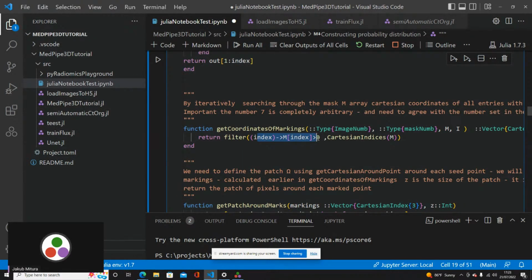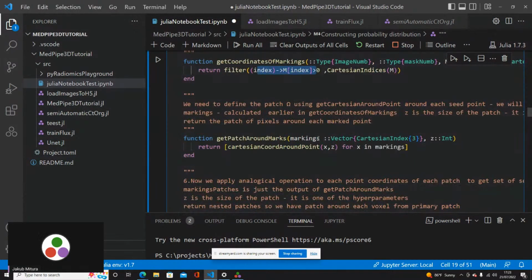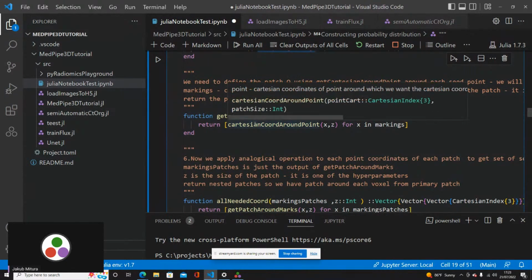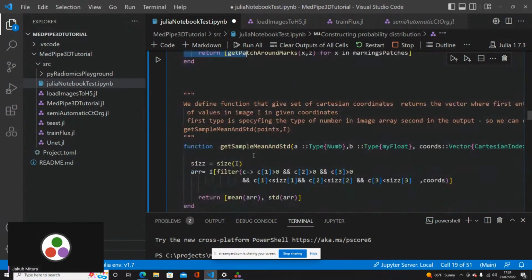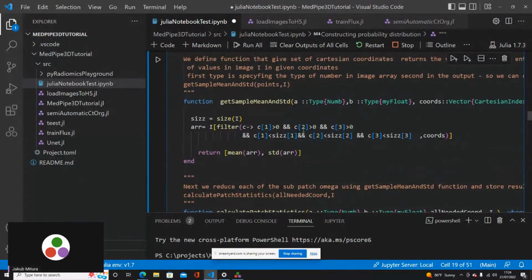Basically all of the indexes that we annotated, because we started from all zeros, so everything that is not 0 is our annotation. And here it's basically the same as earlier: we get a patch around, and a patch around the patch, because we need to get all of the points properly. Here is important: we get the sample, mean and standard deviation. Around each of the voxels, we get this neighborhood.